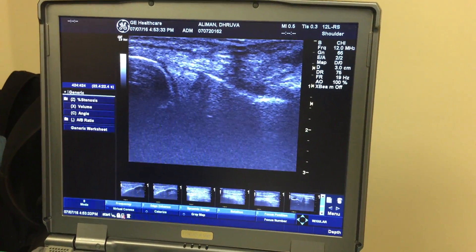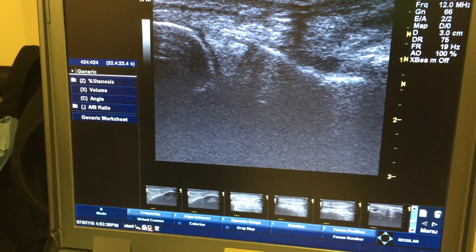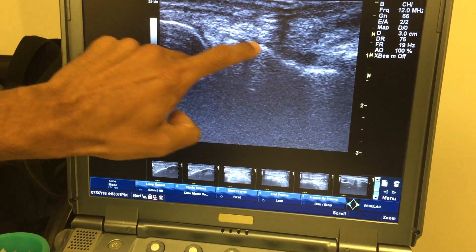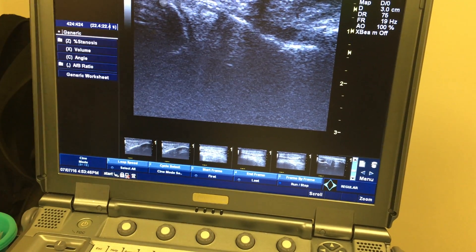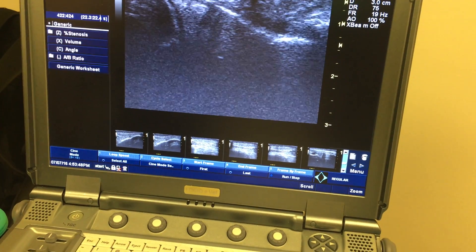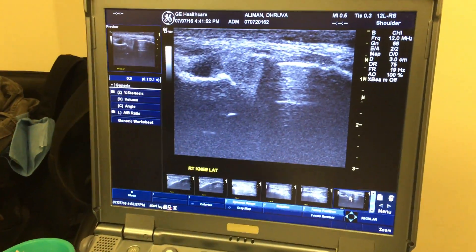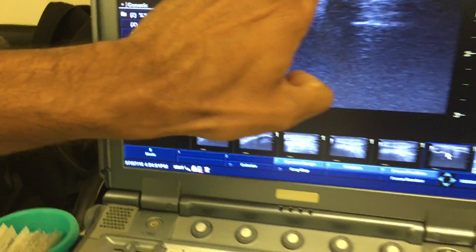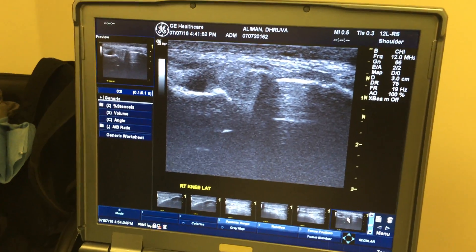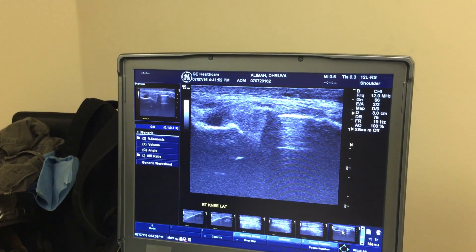Hit freeze — the bottom right button on the ultrasound. Bone, bone, meniscus — all congruent. Now your meniscus — I'm going to point it out again. Do you see how it's popping out? This line right here — that's way out. It's extruding outwards.